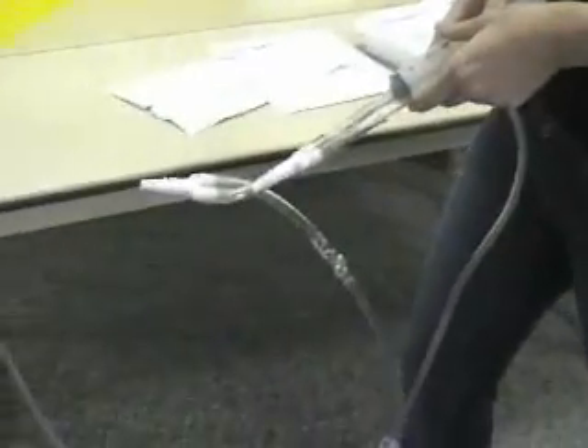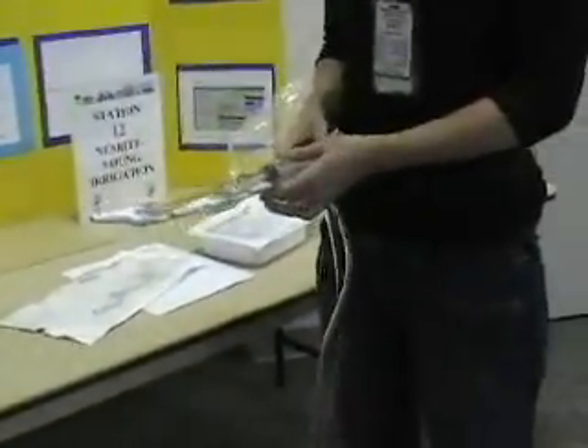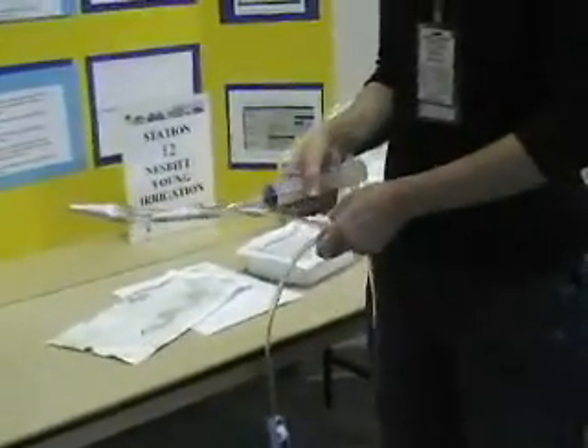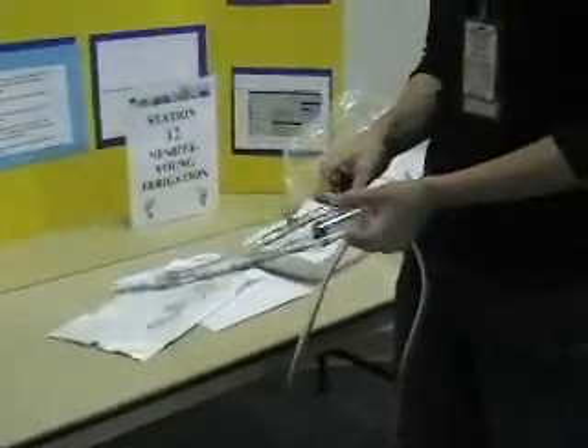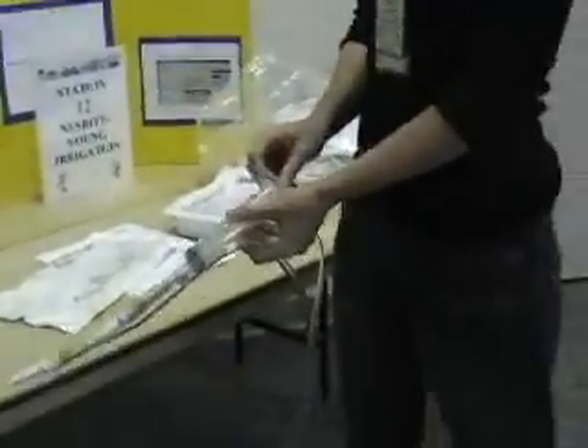A lot of times you'll know it's time to irrigate because patients will get a lot of bladder pain and spasms, and that's when you really have to irrigate to get rid of the stuff. You just have to know your tubing — the tubing going to the bag, the tubing going to gravity, and the tube going to the patient — and which one is clamped and which one is open. Your dominant hand is for the flushing, and you use your non-dominant hand to clamp.